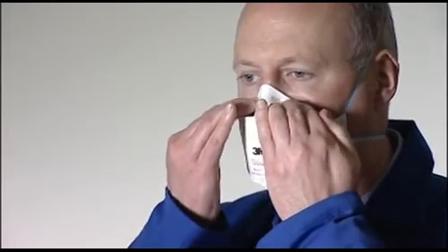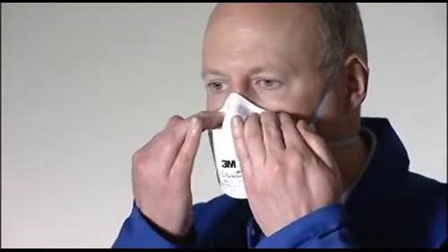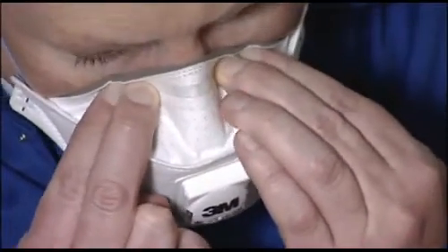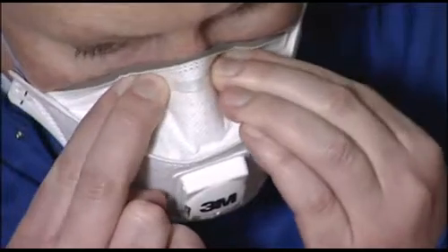Using both hands, mold the nose clip to the shape of the nose to ensure a close fit and a good seal. Pinching the nose clip with only one hand may result in less effective respirator performance.